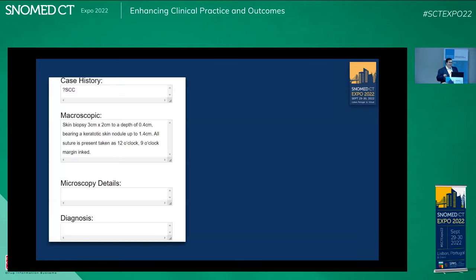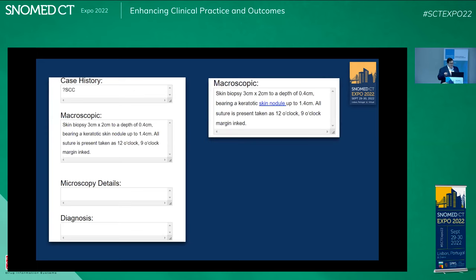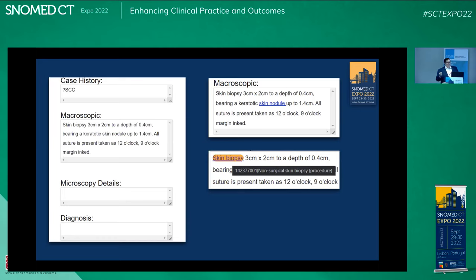What did we actually make with all this? First, my dad said can we start with a web app for reporting? We put in some case history and macroscopic description. He then asked if we could link it up to all the SNOMED stuff. We trained a model that understood SNOMED and could make predictive analysis. When you highlight something in the web app, it links to the SNOMED concept — for example, a skin nodule. He then asked can you make it really colorful and show the code? Each different SNOMED concept comes up as a different color in the pathology report. As the AI works through the report, it continuously learns from context, building its model and scoring terms.